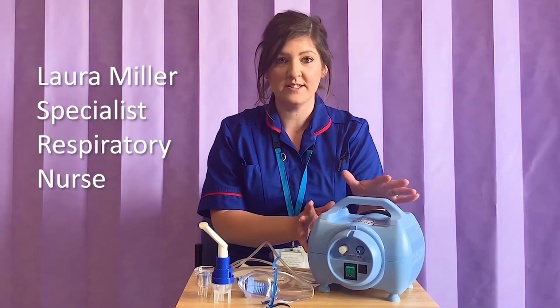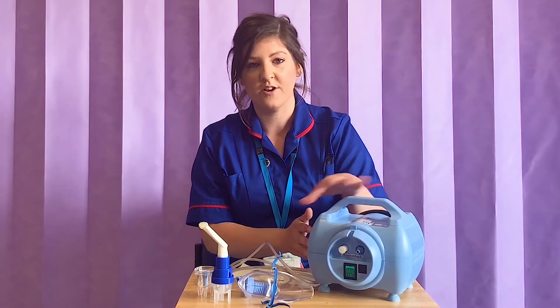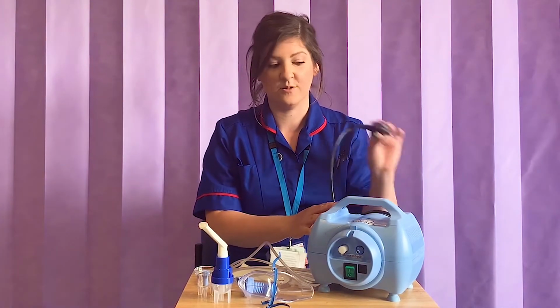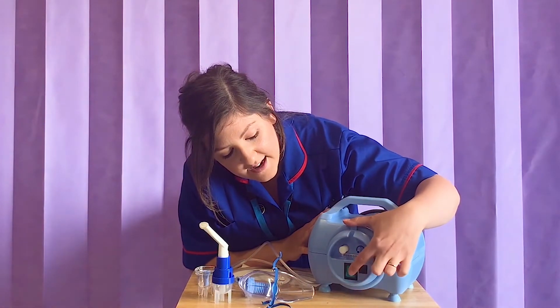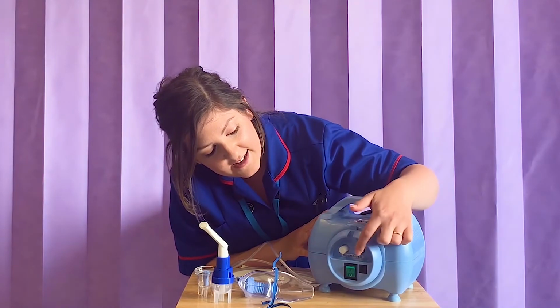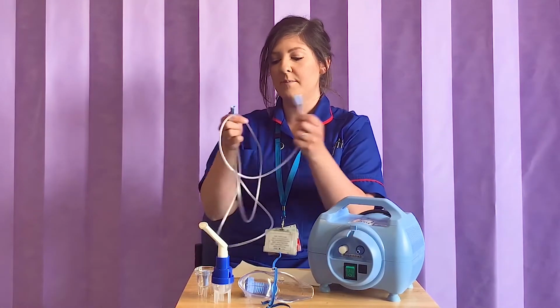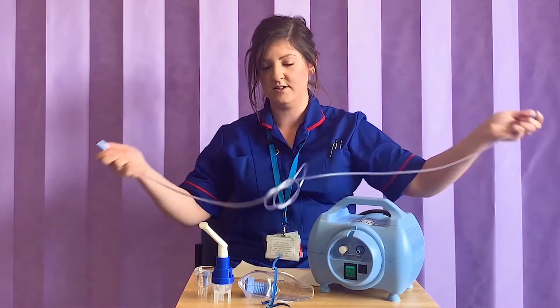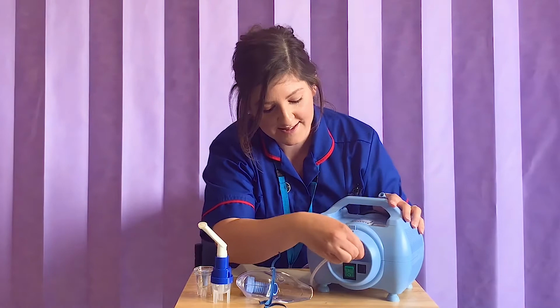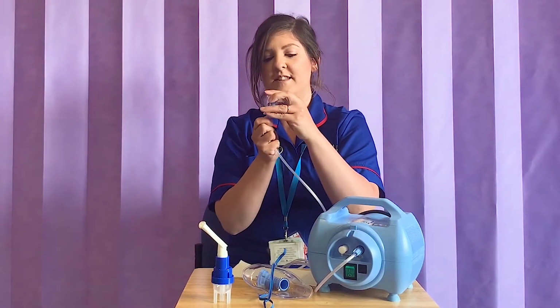They will all look a little bit different depending on the manufacturer, but will consist mostly of a compressor unit that you need to plug into the wall. There'll be an on-off switch somewhere, which should be clearly visible, and a port to pop your nebuliser tubing in. Most nebuliser tubings will have the same ends at both ends, so you can attach them on there like that, and then you want to attach your medication chamber onto the other end.